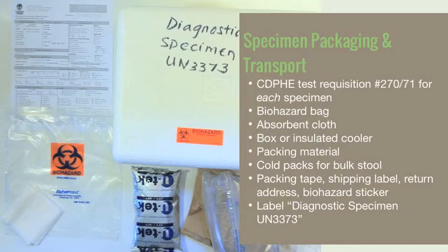If you're shipping the specimens to the CDPHE lab via courier service, you typically do not need a shipping box, but you should ensure that the container has clear instructions on where the specimens are being delivered.